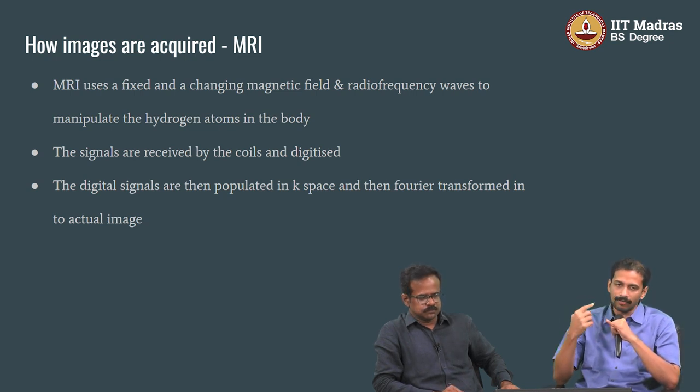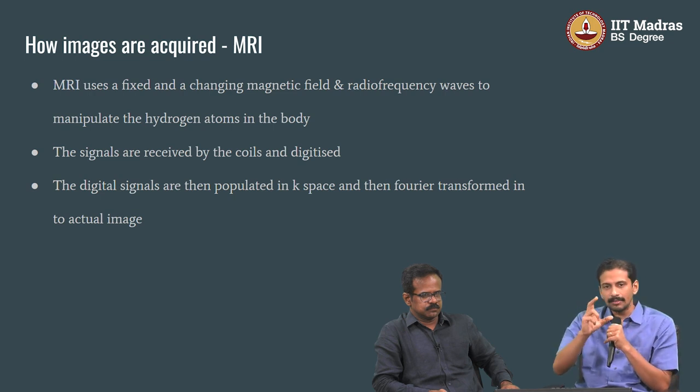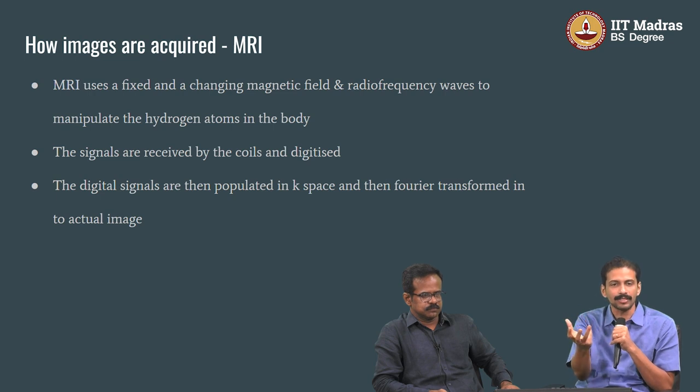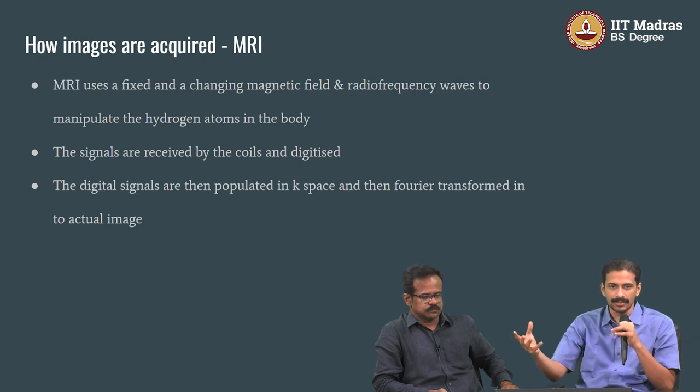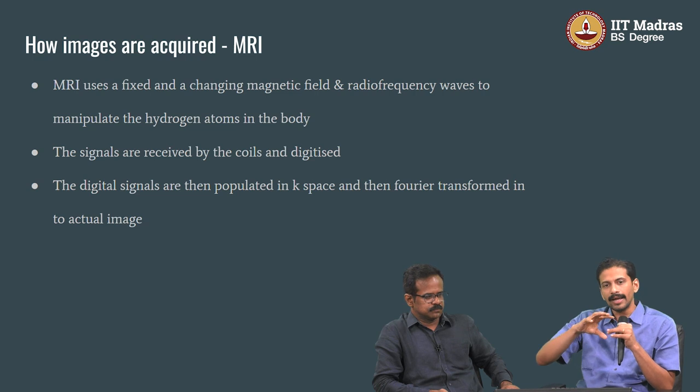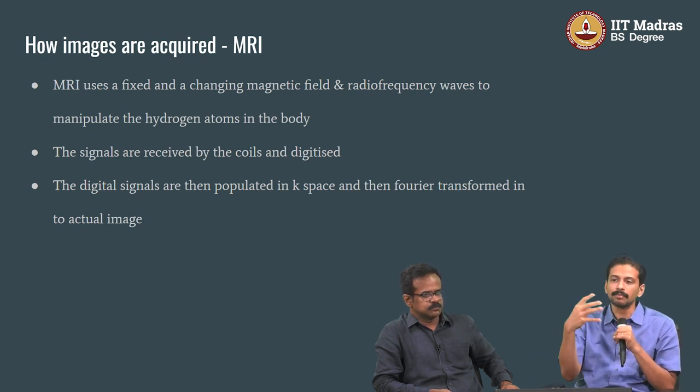The other benefit of MR is contrast resolution. CT has a very limited paradigm to look at. CT can just estimate the electron density. The attenuation is purely based on the electron density of the particular structure. Whereas in MR, by constructing different types of sequences, you can evaluate multiple paradigms.